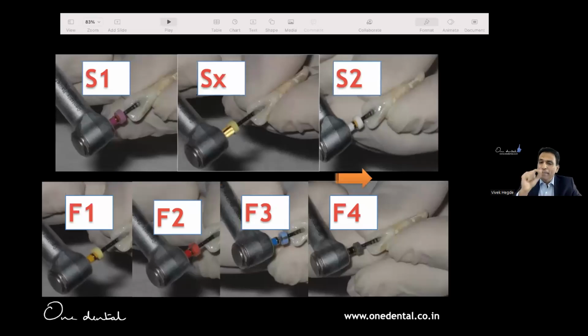Now you see that white debris and dots, they may be a smear, they may be a biofilm, they may be bacteria, they may be debris, whatever. Why do they happen? This is one system of root canal preparation. When you use the system or any system, it cuts dentine, because it's a rotary. When it cuts dentine, the dentine that's cut is not always taken out. It is so difficult to remove things from the root canal system. When you cut dentine, it gets slapped back into the same system sometimes. No matter how good you irrigate, it's still not enough. That's why we will see what protocol we can follow to make it even better in the slides to come.